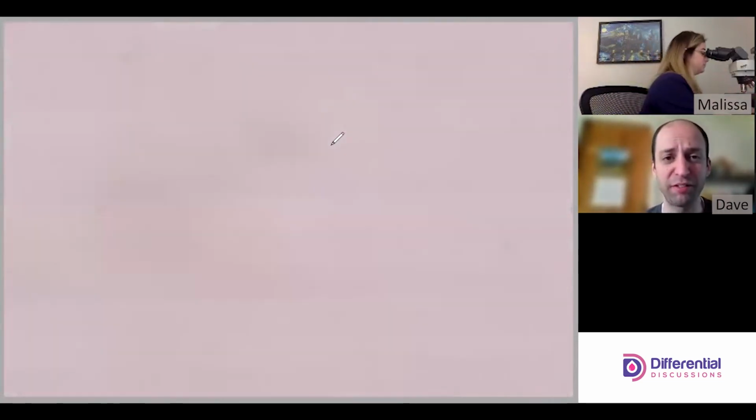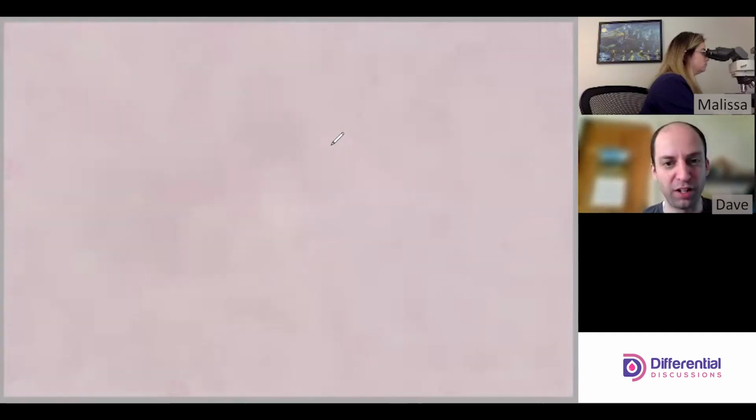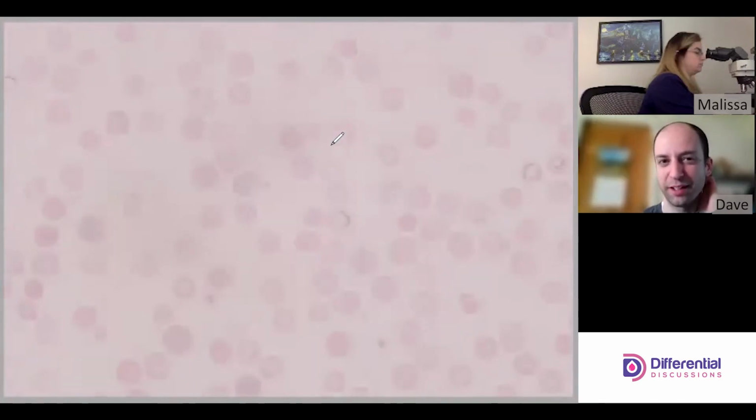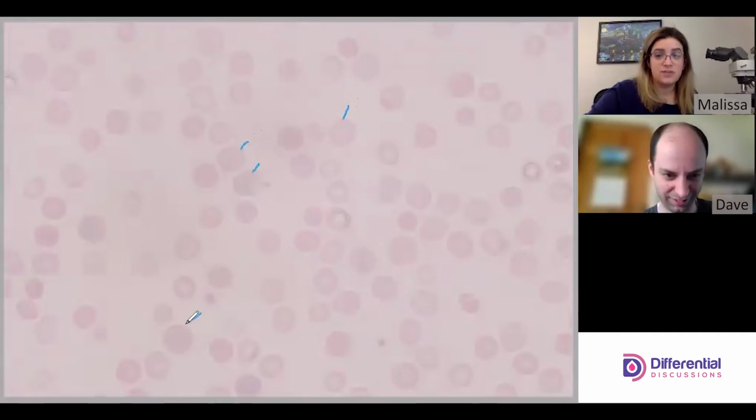Yeah. Sometimes I forget what we're really setting out to do here. And it's tough as I'm practicing as an experienced morphologist to remember the mistakes that students can make and the confusion that can ensue. Yeah, definitely. So it looks like there's more. Like it looks like this is a spherocyte almost. It looks like these are, even though they're big, sizable cells.